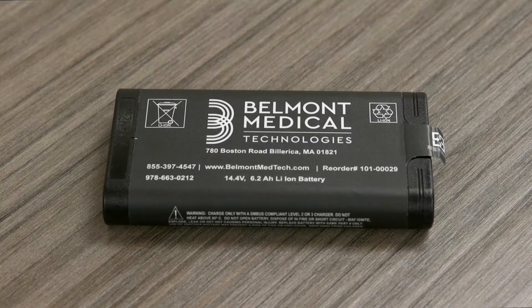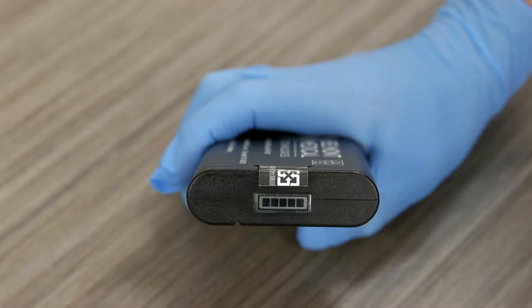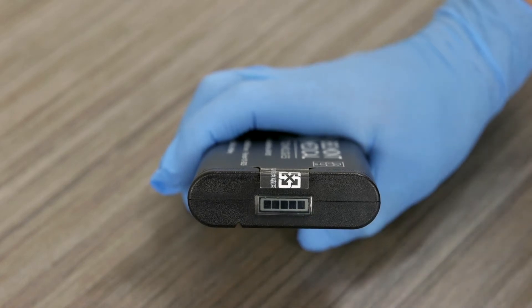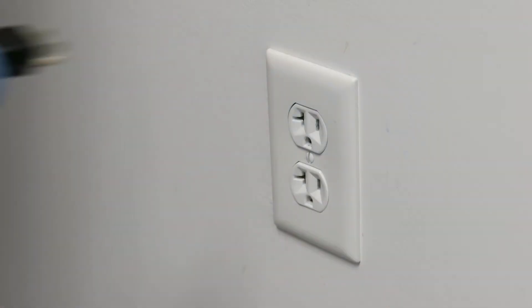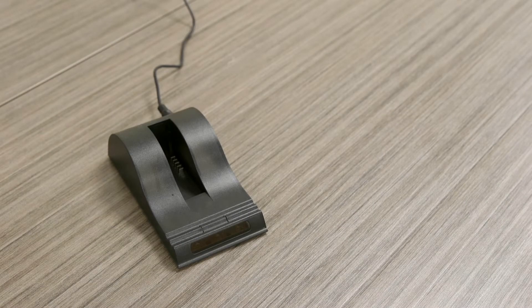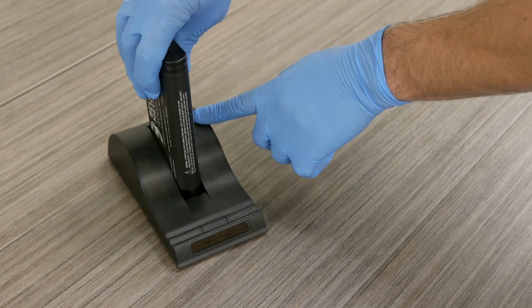The BuddyLite is powered by an interchangeable battery pack that requires minimal maintenance to ensure continued performance. A small 5-segment LCD panel located on the top of the battery displays the battery charge level. Each LCD segment represents 20% of the full charge capacity. To charge the battery, first connect the charger to a power source and place it on a flat surface. Place the battery into the battery charger bay, ensuring that the 5-pin connector is fully seated.